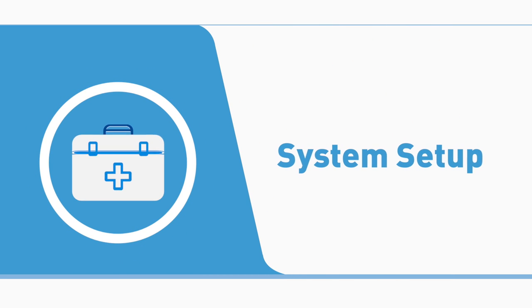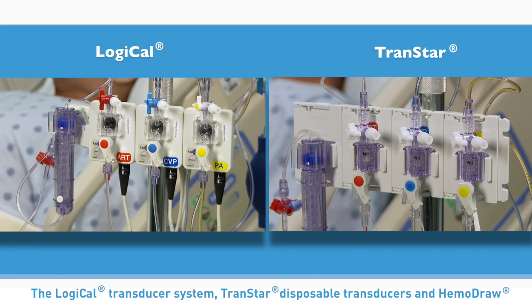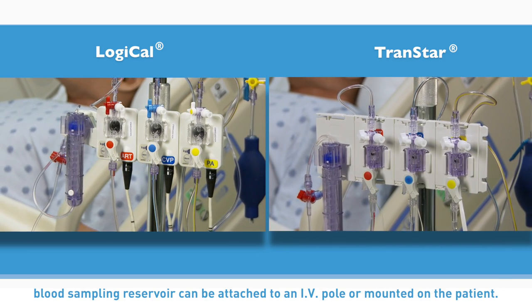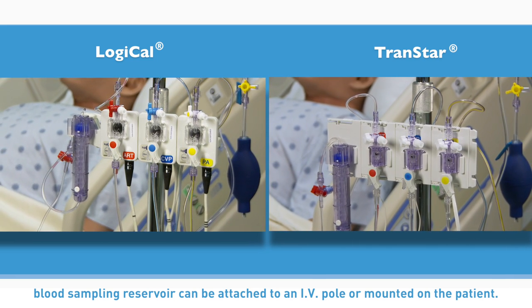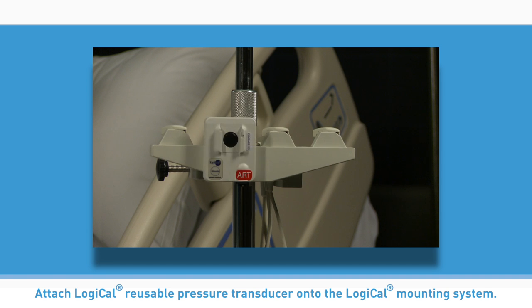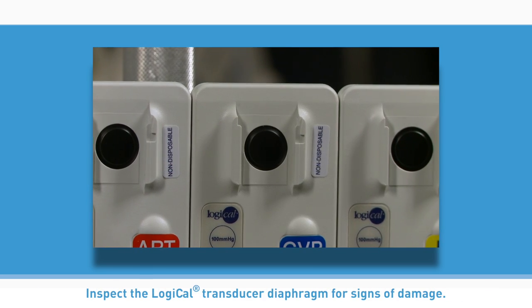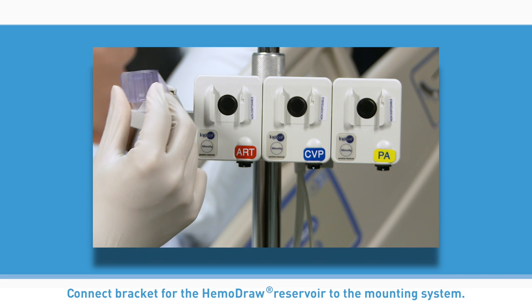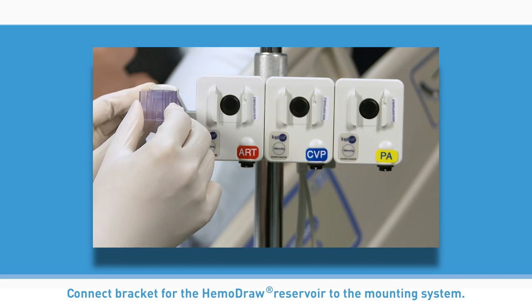System setup. The Logical transducer system, Transtar disposable transducers, and Hemodraw blood sampling reservoir can be attached to an IV pole or mounted on the patient. If using an IV pole, connect the Logical or Transtar mounting system to the IV pole. Attach the Logical reusable pressure transducer onto the Logical mounting system. Inspect the Logical transducer diaphragm for signs of damage. Connect the bracket for the Hemodraw reservoir to the mounting system.